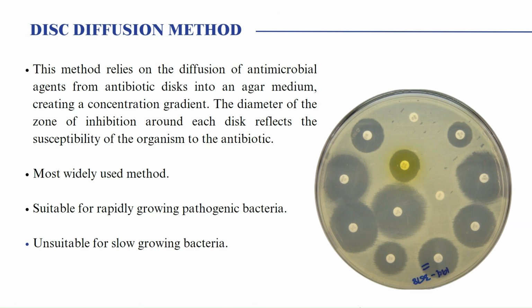The first method is the disk diffusion method. This method relies on the diffusion of antimicrobial agents from antibiotic discs into an agar medium, creating a concentration gradient. The diameter of the zone of inhibition around each disc reflects the susceptibility of the organism to the antibiotic.